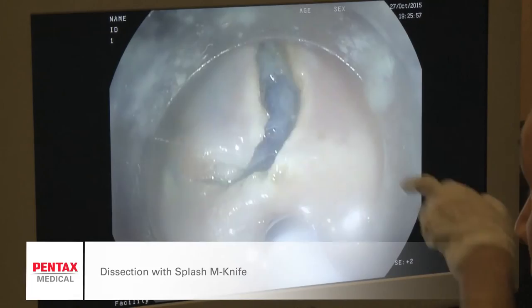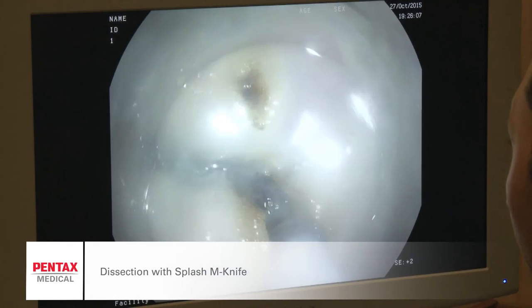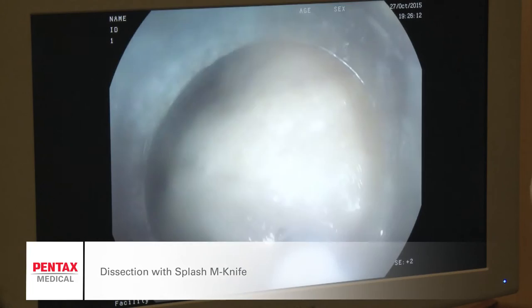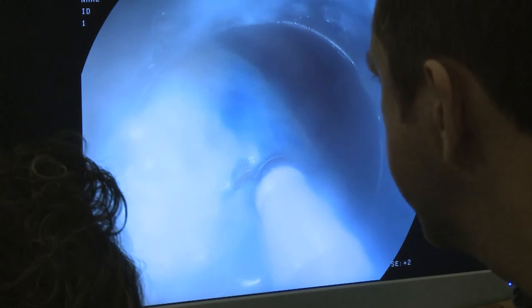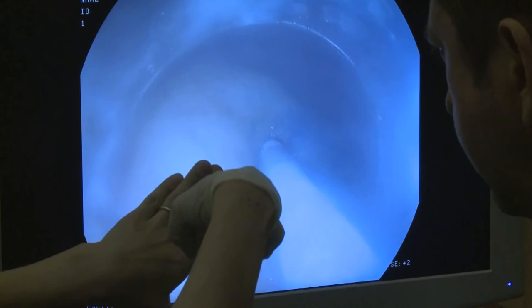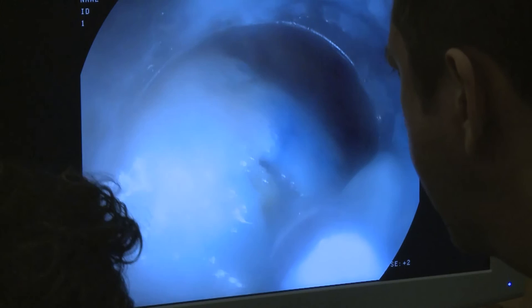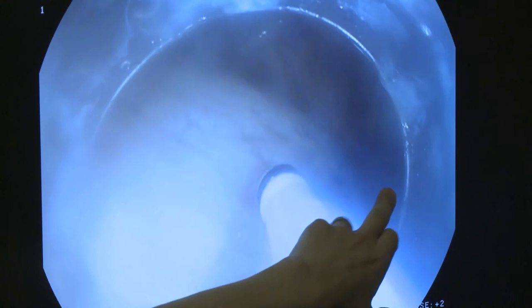Yes, the right side. Maybe this white tissue is the muscularis mucosae. Oh, good. Great. It is hard. Stick a little bit more. Now the mucosa and the needle are in parallel. More tangent is better. So down. Pull back and down. Yes, like a tangent is better. And hook the tip. Hook the tip here.